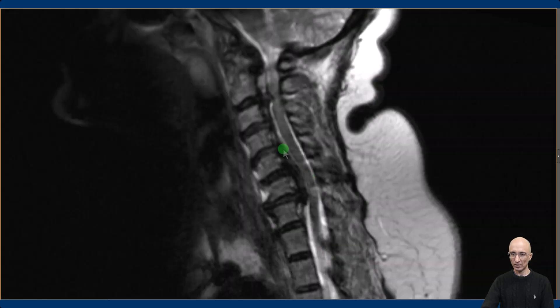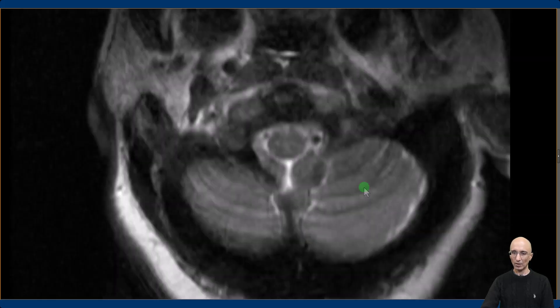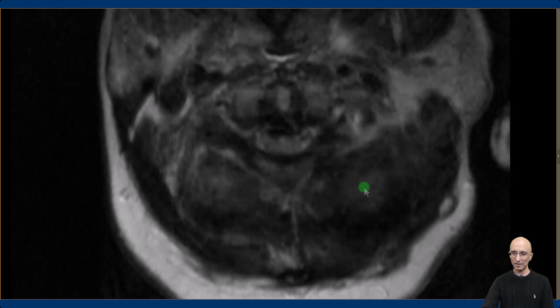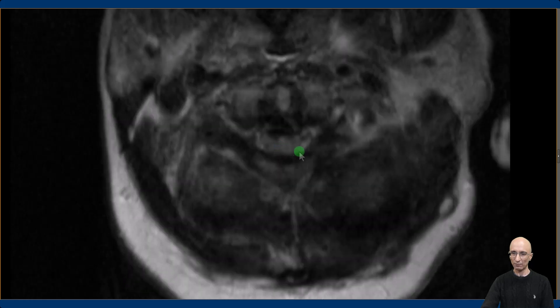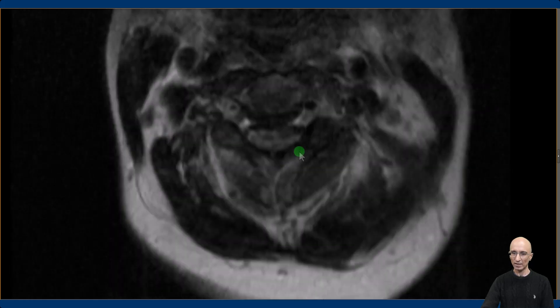Similar findings are also identified on the sagittal T2 images — marked ossification of the posterior longitudinal ligament causing severe narrowing of the spinal canal. On the axial T2 images we can see the ossified posterior longitudinal ligament causing severe narrowing of the spinal canal with flattening of the spinal cord. At multiple levels we can also identify high signal within the spinal cord.